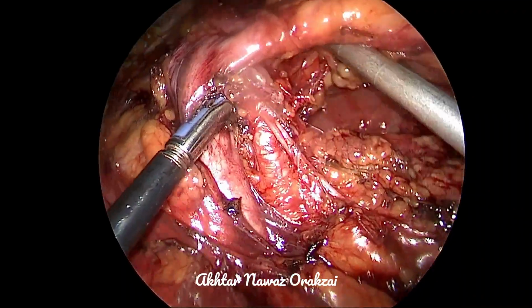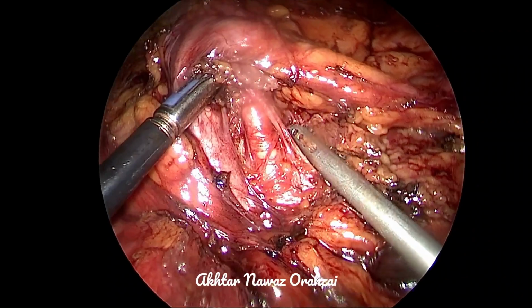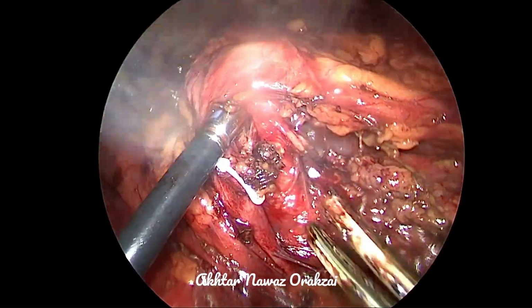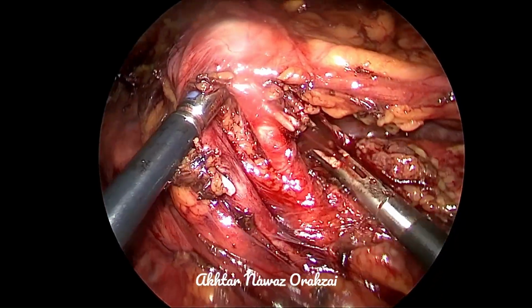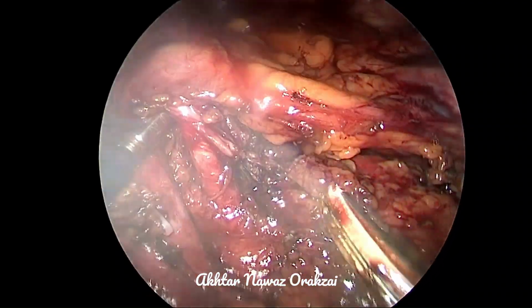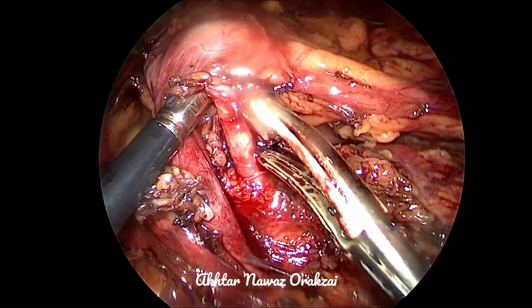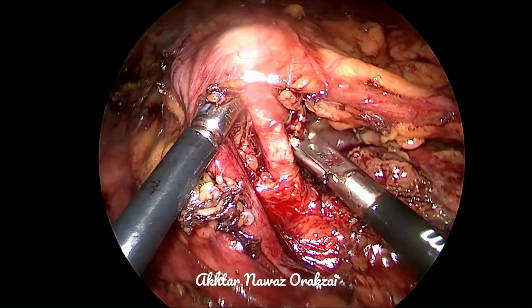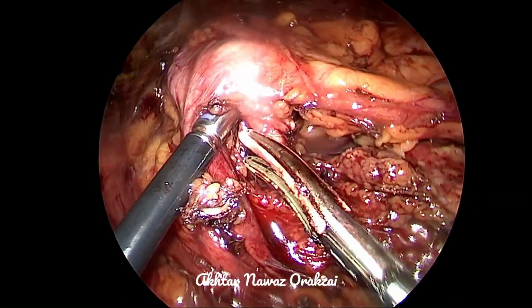So we found the artery in the usual location. You can see that the artery is quite long, and we have dissected the tissue around the artery, which is helping us to have a lengthier portion of the artery. The lengthier the artery, the more convenient it is to apply the clips. So you dissect the lymphatic tissue and the fats around the artery, and then you will find a lot of space.